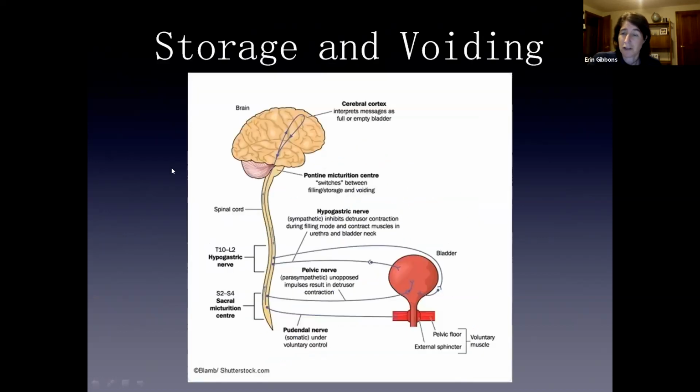So in terms of the bane of all urologists' existence, how we actually empty our bladder involves both the sympathetic and the parasympathetic systems, as well as more voluntary control. Very busy slide, but the big thing we're measuring with the EMG is right here, the external urinary sphincter, which is under somatic control from the pudendal nerve. When we are sitting and filling, that is active. And so as the bladder fills, that's where you're going to see this EMG noise, and I'll show it in another picture in a second.